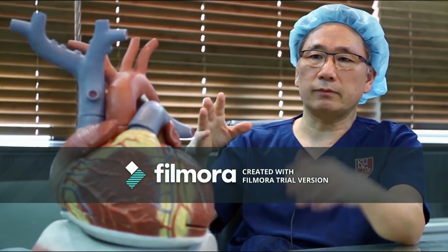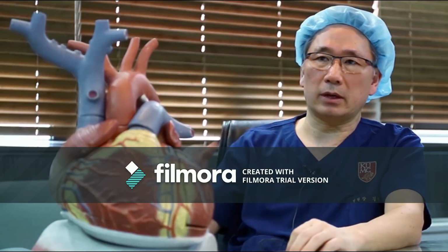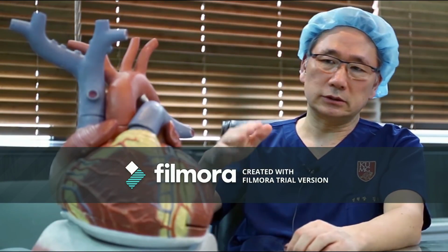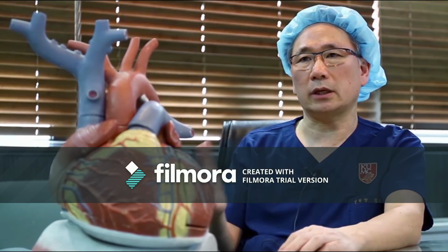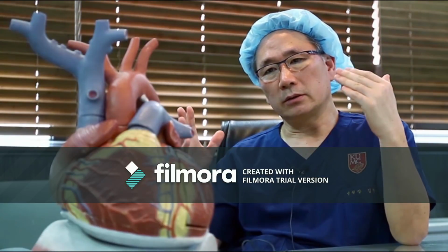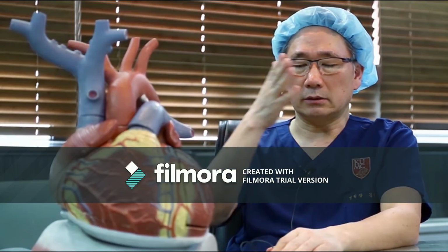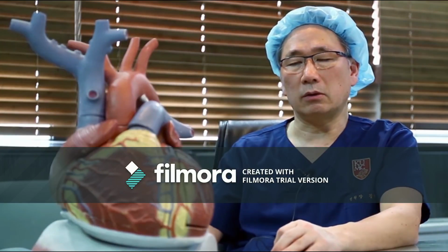So after PVI, we create the 3D mapping, 3D CARTO mapping. CARTO, the setting I already mentioned. So CARTO-guided LA ablation first, and if AF is sustained, we move to the right atrial CARTO. In our series, we experienced that in about 75% of the patients after LA and RA catheter ablation, AF terminates to atrial tachycardia or sinus rhythm.